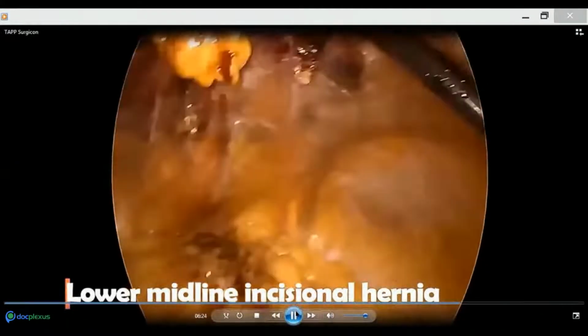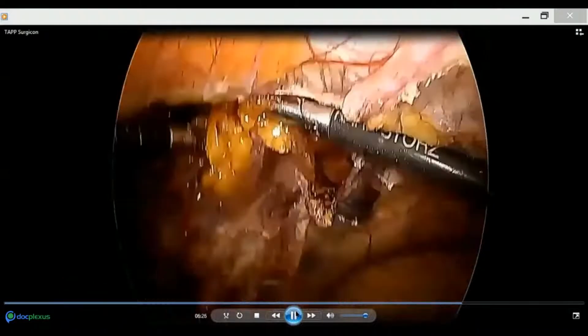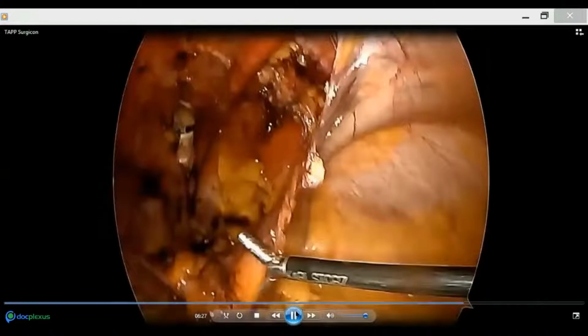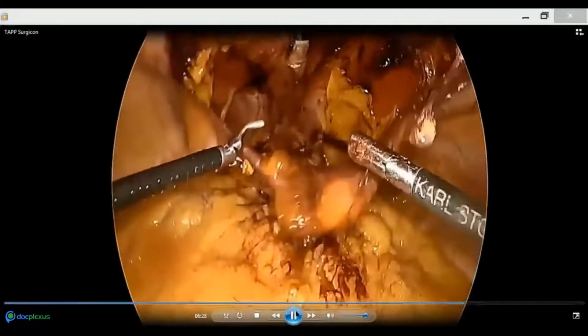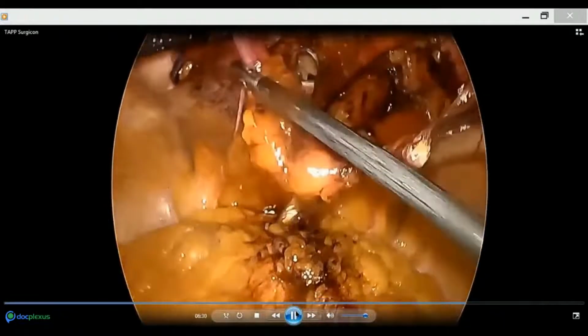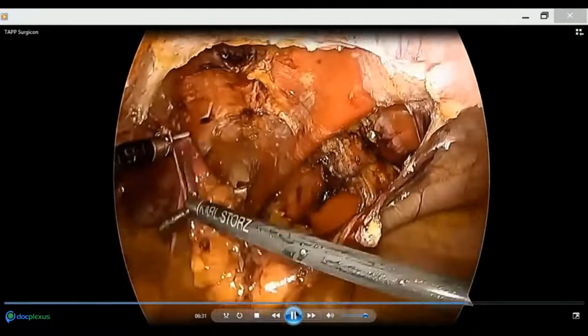So my take home message would be, it's a very cost effective technique with almost no postoperative pain. It's technically easier compared to other newer techniques which are coming for ventral hernia repair. It's reproducible. You can do it for any abdominal hernias up to 4 to 5 centimeter defects, and it definitely needs patience and good surgical suturing skills.